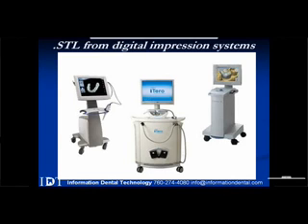You couldn't open up your software and put STL in it, but we can definitely use Blue Sky Bio and treatment plan your case in Blue Sky Bio. Send us the final one, and then we can import the STL into that. It's one of the very few software programs that allow us to do things like that.